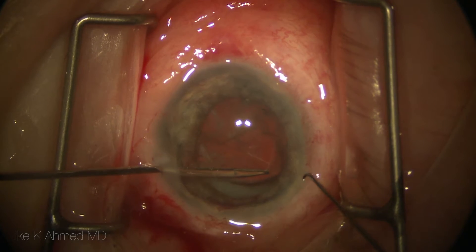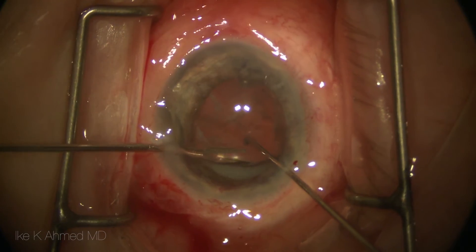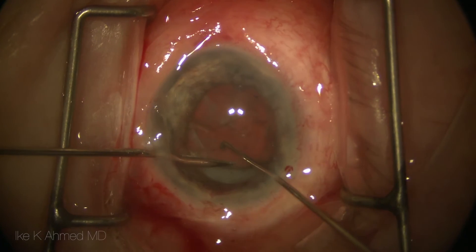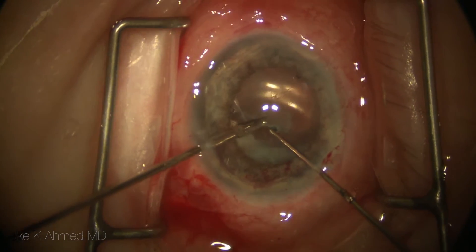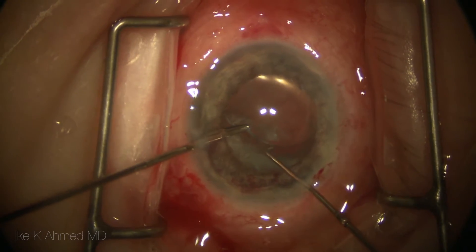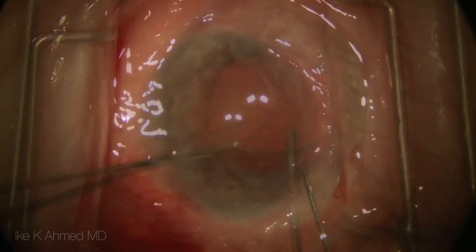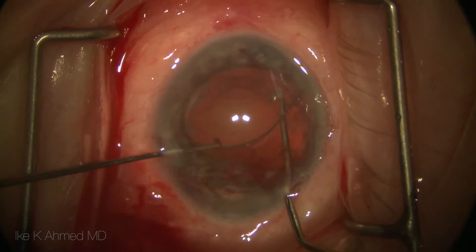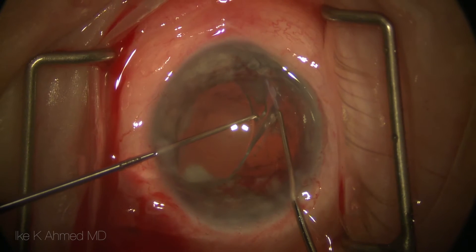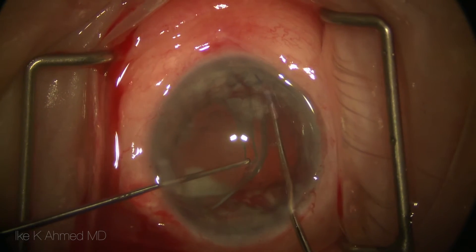The in-the-bag lens, which in this case is a single-piece acrylic lens, is a little more difficult to extract. Here we're using a pair of micrograspers holding the fibrotic capsulorhexis edge while a cannula is used to push down the lens and then elevate it off of the posterior capsule. Cohesive viscoelastic is used to inject and visco-dissect open the capsular bag, and then the difficult task of removing the haptics from the capsular equator is attempted.